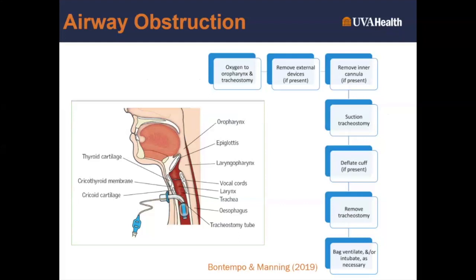If you're at the paramedic level, you may need to replace it with an intubation. You may have to intubate their stoma essentially. If that is outside your scope of practice, I'm not saying do it. Please work within your scope of practice. At any rate, you're then going to bag mask ventilate or intubate as necessary.